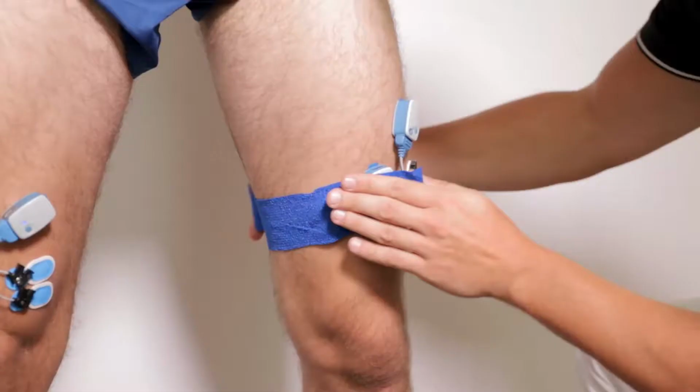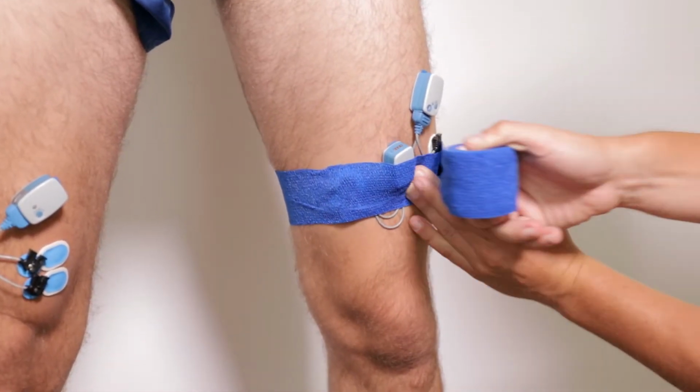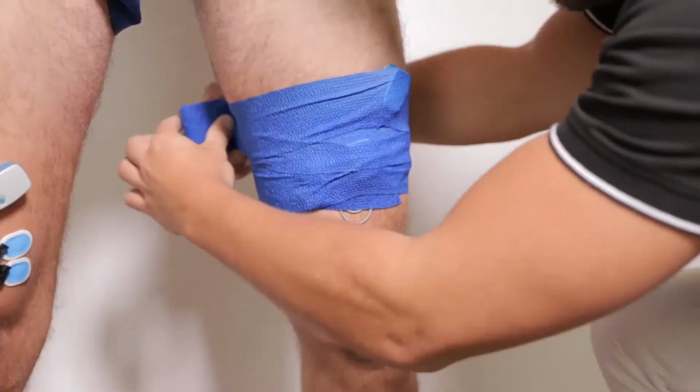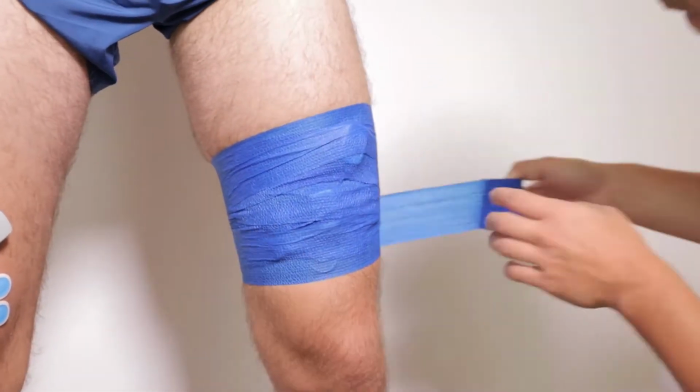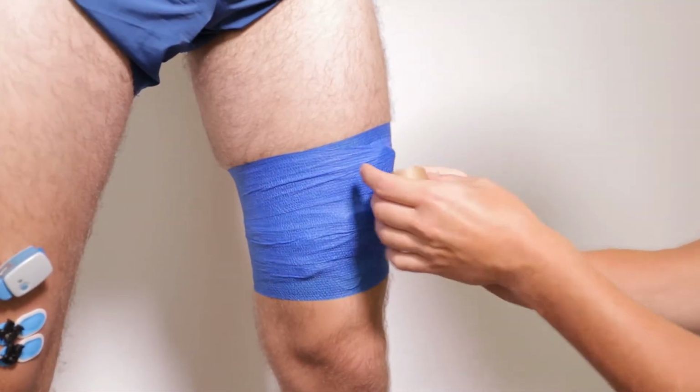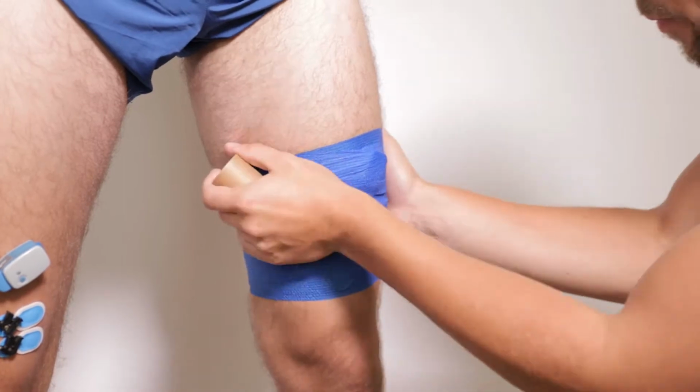Step 3. Good protection and taping. For fast movements and highly dynamic measurements, you can protect your EMG electrode with flexible or elastic tape. The electrode itself can be covered with it to reduce the risk of coming off the skin or even losing your electrode.